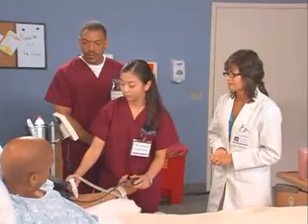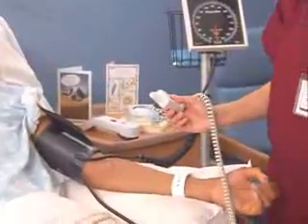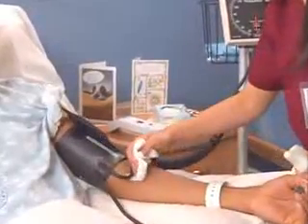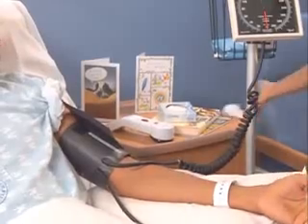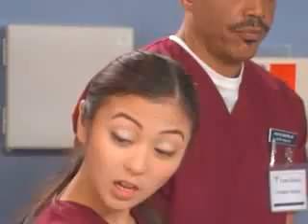Okay, now remove the Doppler tip and turn the Doppler off. Wipe off the excess gel on the patient's skin with a tissue. And then remove the cuff. And then you can clean the Doppler. There you go. Well, that was quick and easy. How do I look? Your systolic pressure is 120, which is fine.